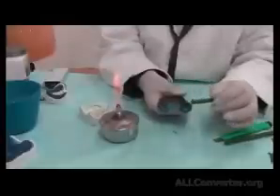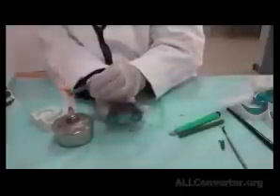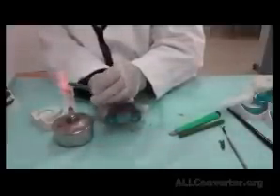Now, in the area in the middle, I not only add the material to the border, I'm also adding it onto the posterior part of the hard and soft palate, the firm soft palate, because we know this is the hard palate, but here there is the beginning of the soft palate, but it's still not mobile. This area is made of glandular tissue, so it's the posterior part of the palate that is not mobile. It's composed of glandular tissue in this area, especially in this one. And I'm going to use these glandular areas to do what we call a post dam. So an extra pressure over the fitting surface there is recommended.